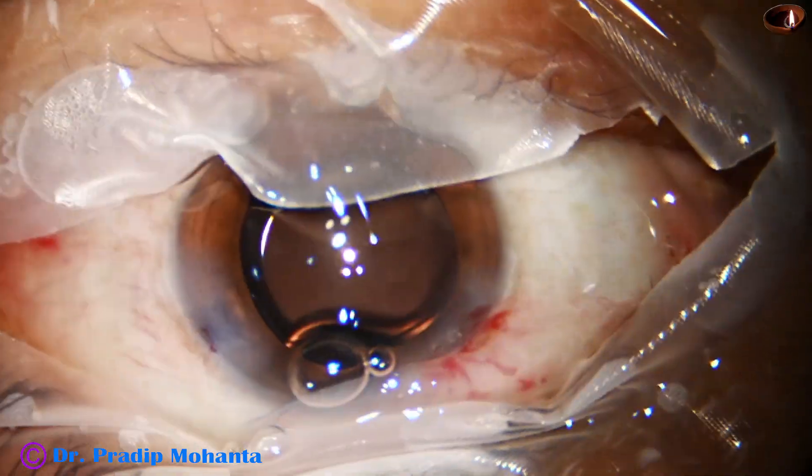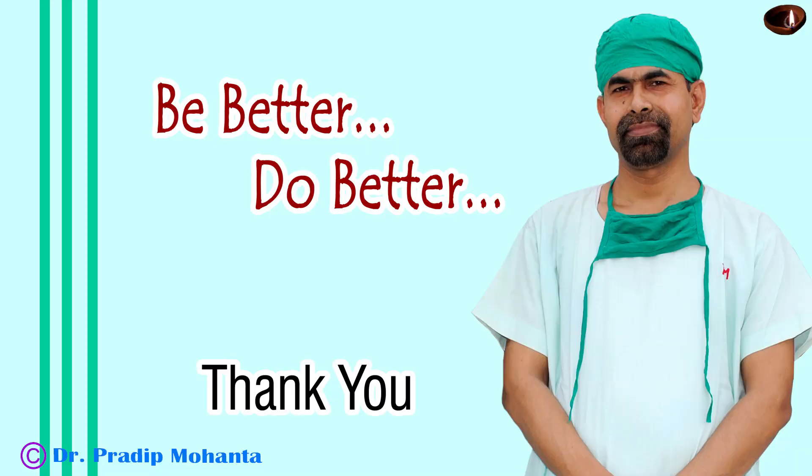And now we are going to conclude the case. Thank you very much for your attention. I hope this video will help you in developing your surgical skills and will encourage you to use the epinuclear shell as a cushioning material — as a contact lens to protect the posterior capsule.